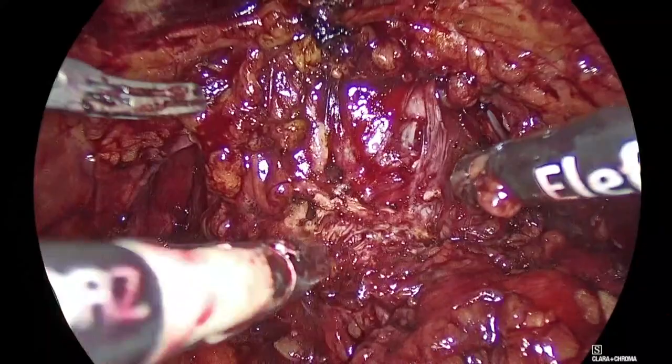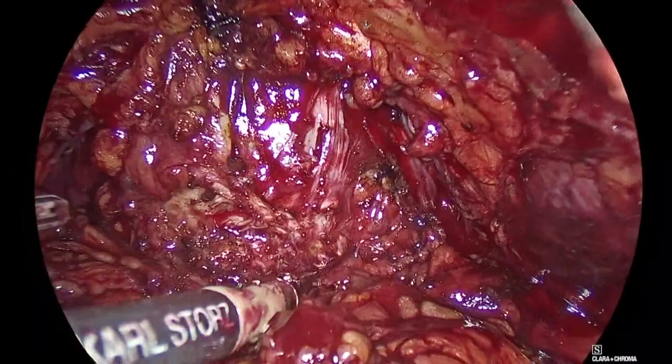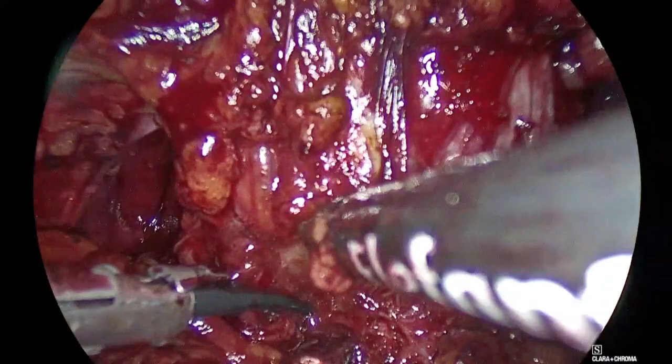Okay, come closer, Padeli. Evangelos, this is Martin Schostak from Germany. Put your grasper. Do you sometimes move the catheter or fill the bladder? I did this in the beginning, this defines whether, put your grasper here. Good. So, don't do this, Mario. Come in. You see, everything is stuck here, huh? It was really tough in the beginning to proceed with the creation of this whole space here.